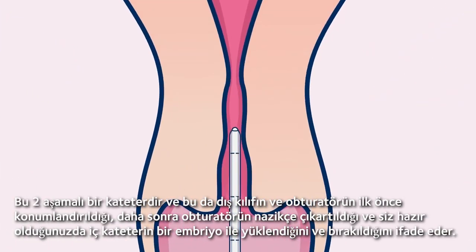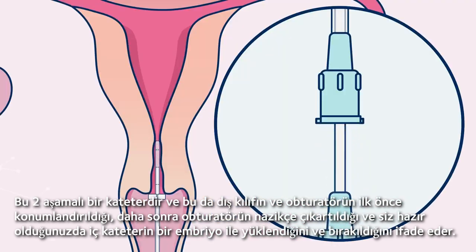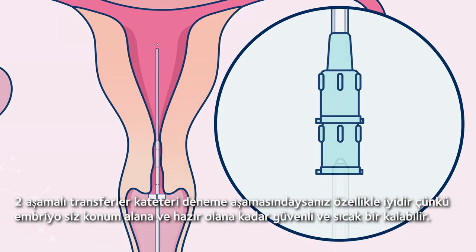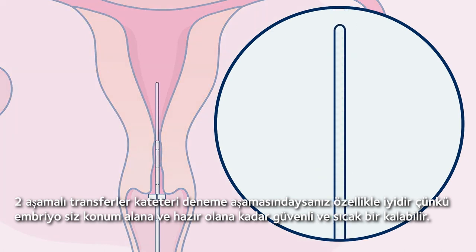This is a two-stage catheter, which means the outer sheath and obturator are positioned first. The obturator is gently removed, and when you're ready, the inner catheter with embryo is loaded and released. Two-stage transfers are especially great if you're trialing the catheter, because the embryo can remain in a safe, warm environment until you're in position and ready.